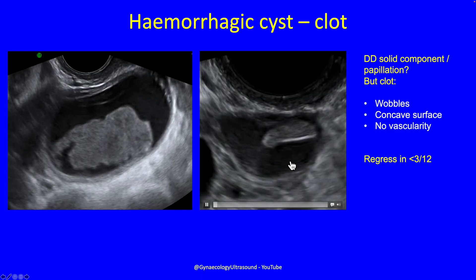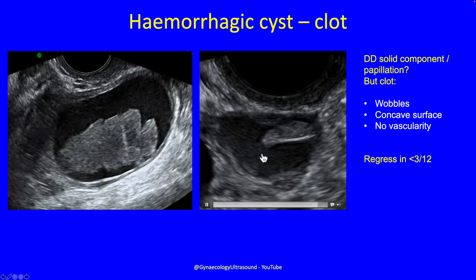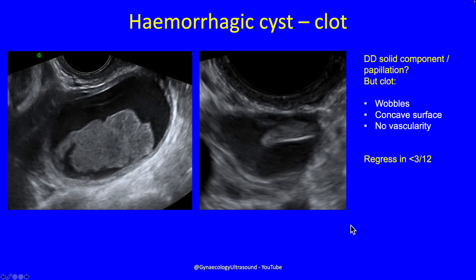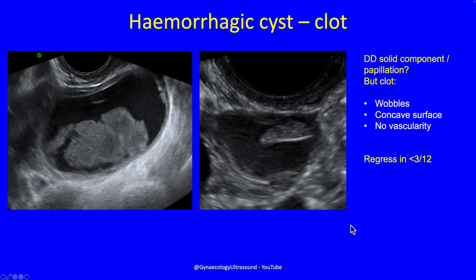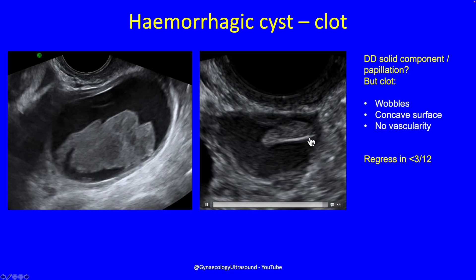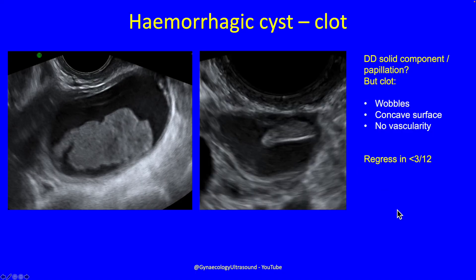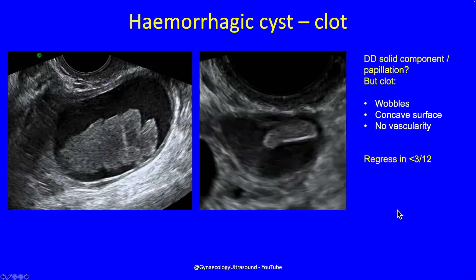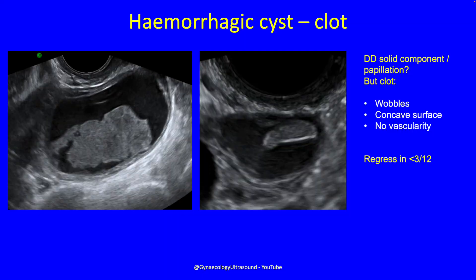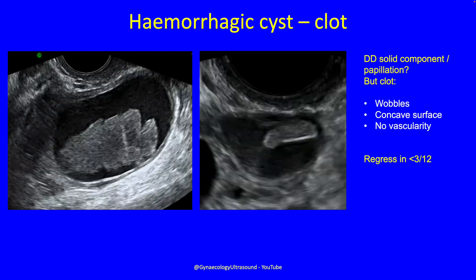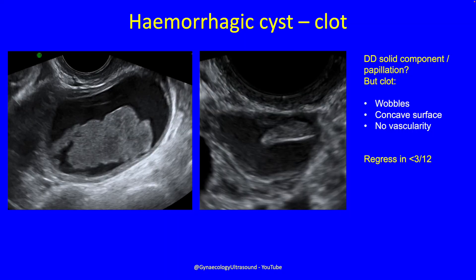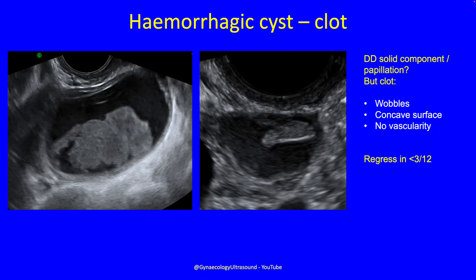In this second example, you can see a concave surface and some calcification with shadowing. A papillation or solid component wouldn't have a concave surface, so you can say these are clots. Also, these would regress in about three months' time, so if you weren't sure and you re-scanned, it would have disappeared by the second scan.